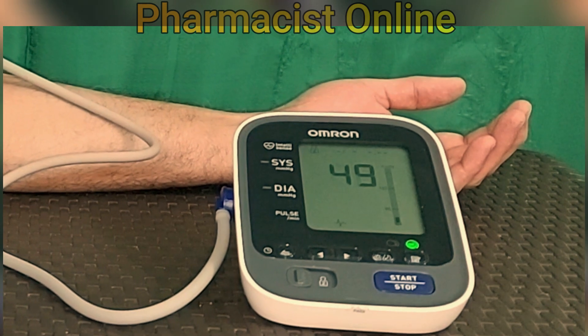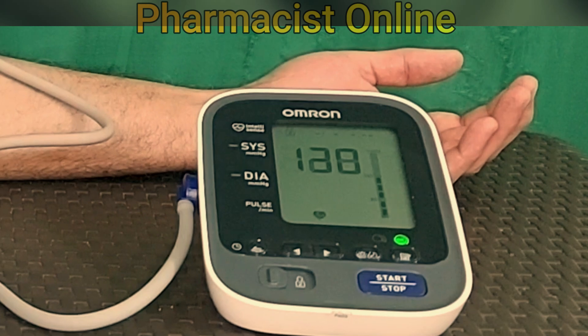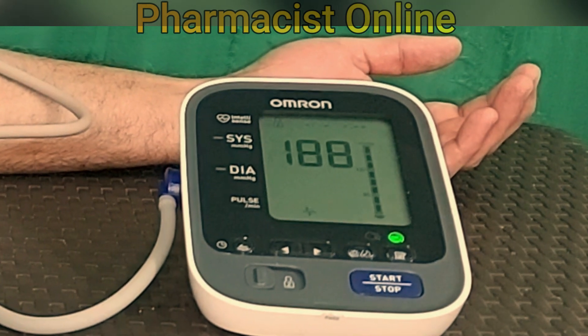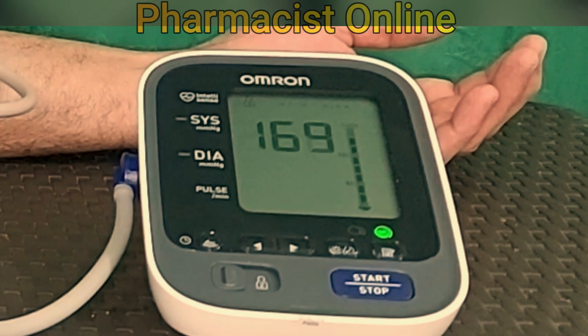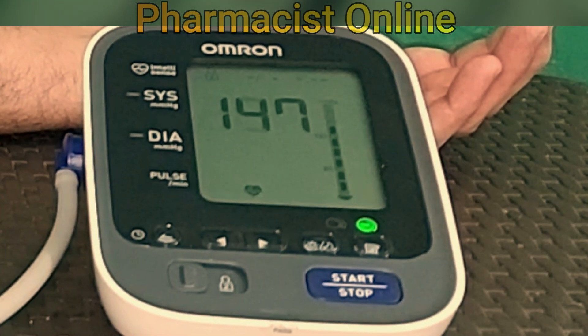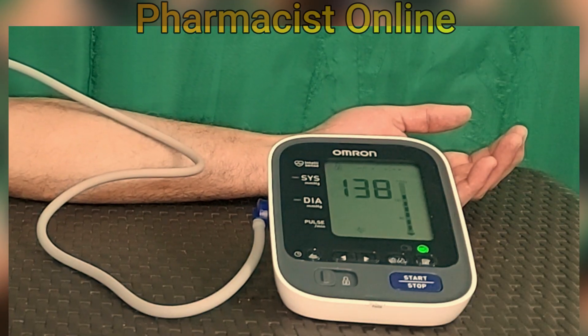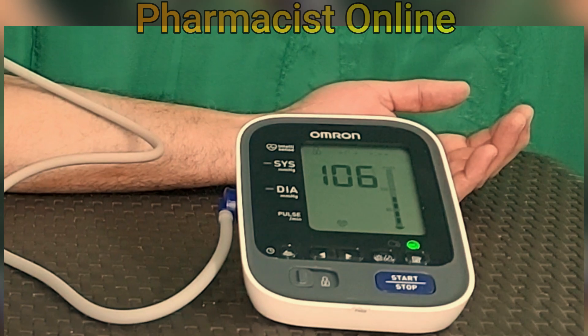If you are measuring blood pressure at home with a digital BP monitor and you get high BP readings, you cannot use any medication for that high blood pressure to lower it on your own. Hypertension is only diagnosed in a hospital setting and only in a clinician's office.